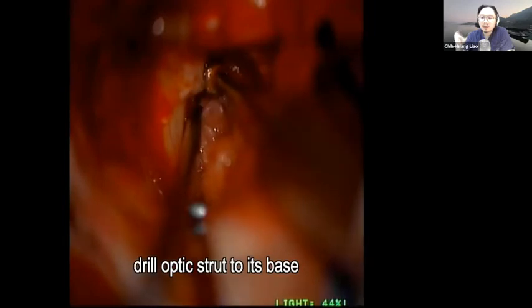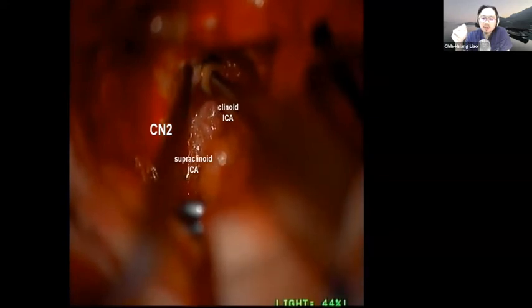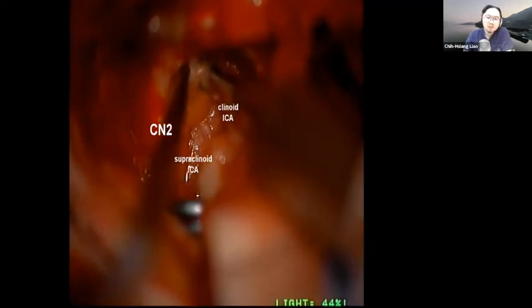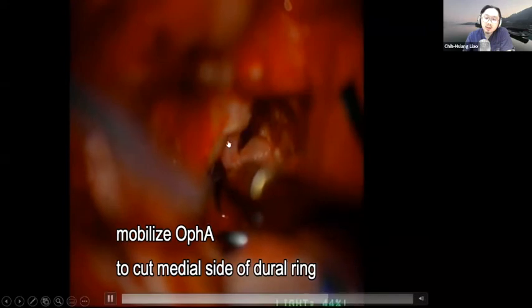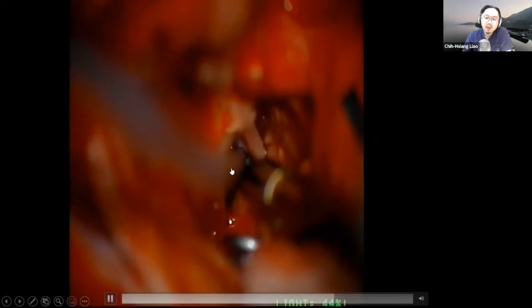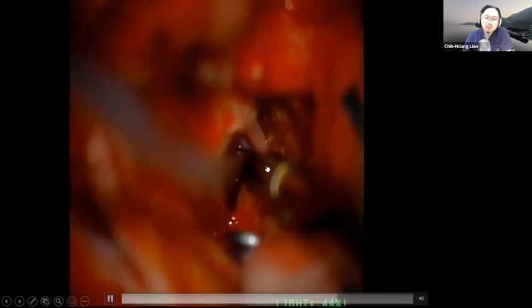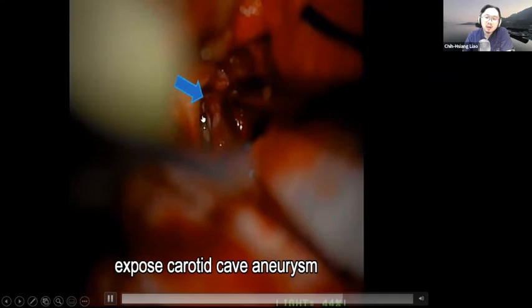Why? Because I did not cut the distal dural ring circumferentially. I mean, the whole ring should be released. Then I can place the clip. So I mobilized. This is the ophthalmic artery. This is the medial side of the dural ring. I cut it all open. And the carotid cave aneurysm is here. The ring is here. If I don't cut the ring open, I cannot advance the clip.